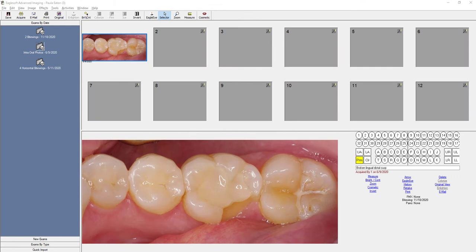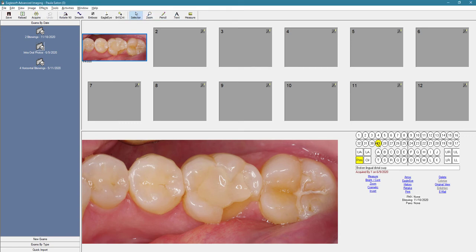For PAs and inter-oral images, since we are not using a pre-labeled template, we need to manually add the tooth number in order to label that image.